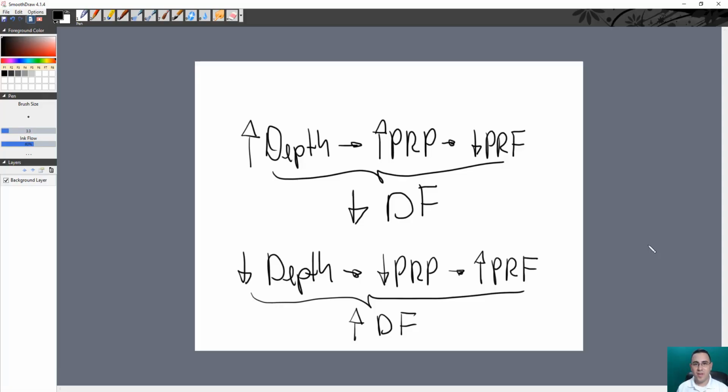This is really important information. So, today we talked about the ultrasound concept. The ultrasound is a pressure wave. It's made of compressions and rarefactions. The compressions are the high density, high pressure areas. The rarefactions are low density, low pressure areas. So we have the acoustic variables: pressure, density, and particle motion or distance.